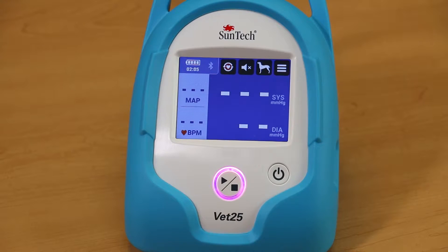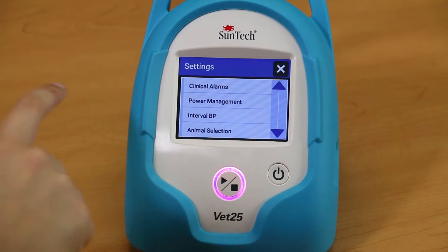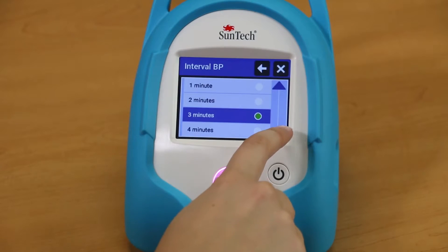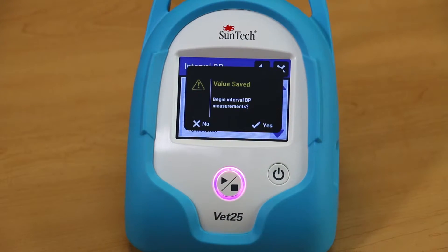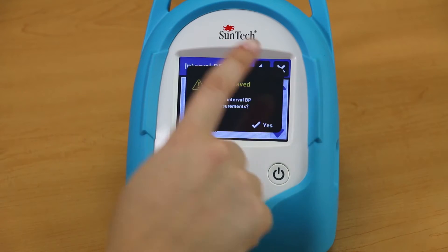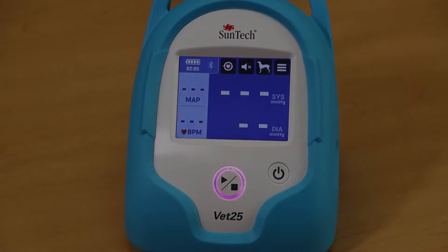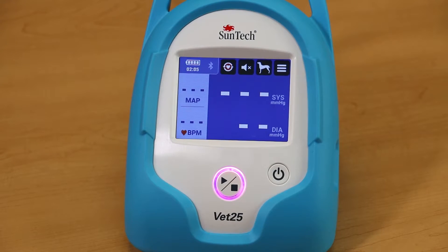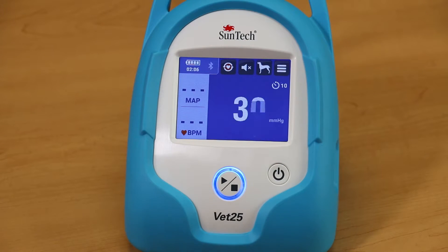To set up Interval BP mode, press the Menu button, then the Settings button. Select Interval BP and choose the time period you would like between BP readings. Once you have selected an interval time period, the VET25 will give you the option to immediately begin taking the first BP reading. Select Yes to begin right away, or select No if you would like to start monitoring later. Once you have set an interval time period, press Menu and then the Interval BP button to begin the first BP reading.